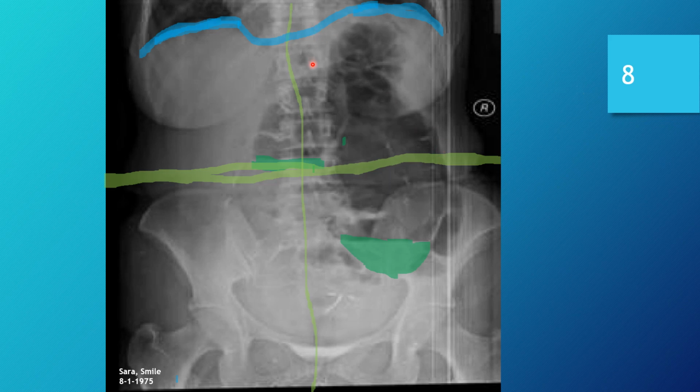Just keep that in mind. The reason I'm saying presumed right and presumed left is because I'm not certain that this image was presented correctly or that it wasn't marked incorrectly. Mid-sagittally, the image is probably a slight bit to the presumed right side, and the patient should be shifted back to the left just a bit to truly center up the anatomy for the mid-sagittal plane on the image receptor.